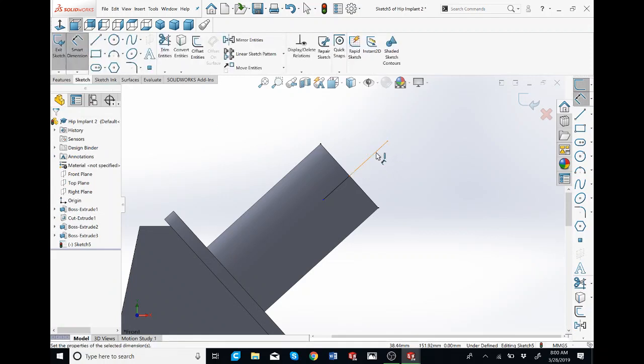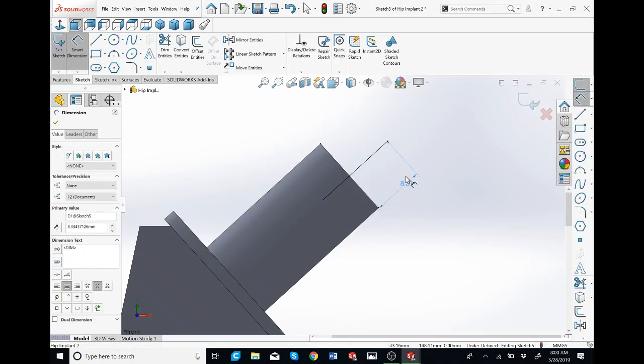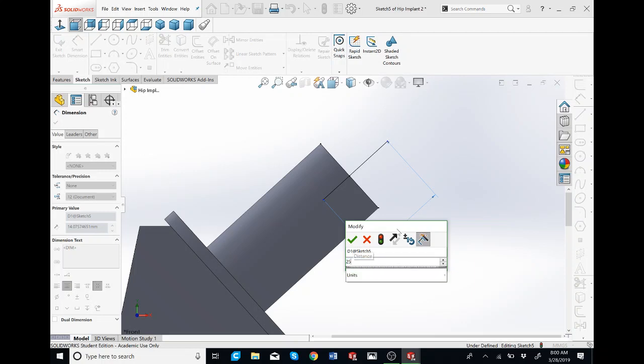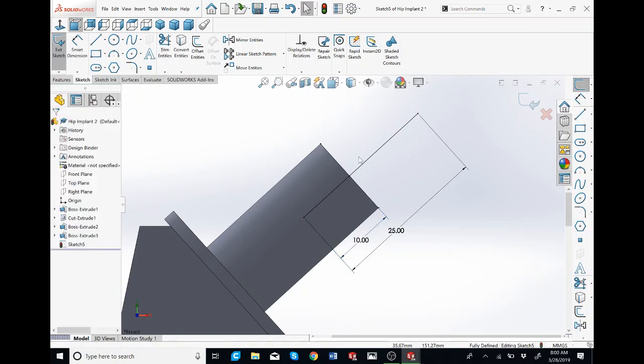I'm going to go smart dimension. I want to make sure it's parallel. I'm just going to hover over like this, click my right mouse button so that it locks in place so it doesn't move anywhere. Oh, I clicked on the wrong one. So I'm going to exit this. I'm going to drag this and then delete it. Click on these 2 points. Make it parallel, and this is 25. And then I'm clicking this point, and then this point over here, parallel again, and make this 10. And press escape to get out of smart dimension.